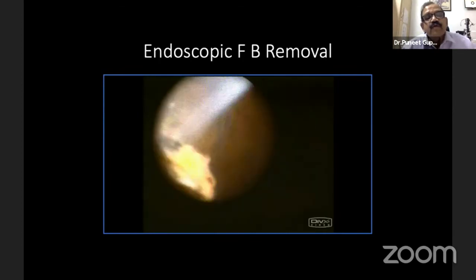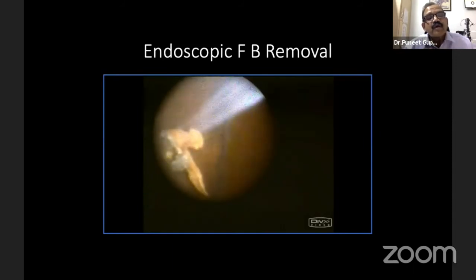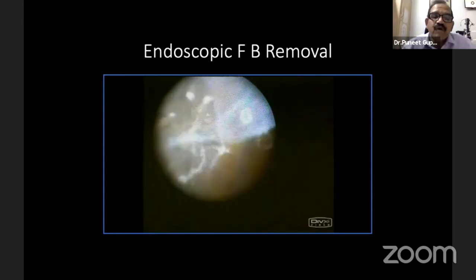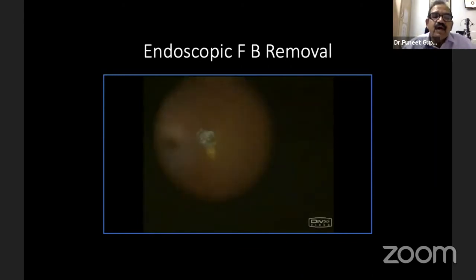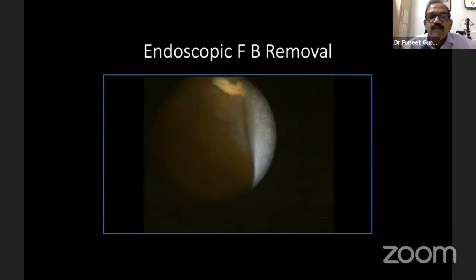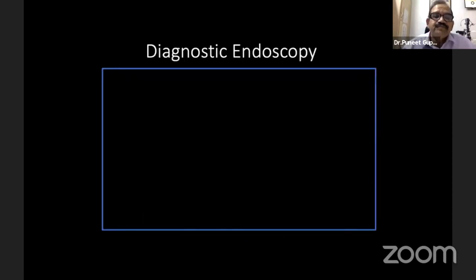But again, this foreign body is stuck at the small sclerotomy site. This sclerotomy site is enlarged. In this process, the foreign body falls again on the posterior pole, and this foreign body is again lifted with the help of the intraocular magnet and removed through the sclerotomy.